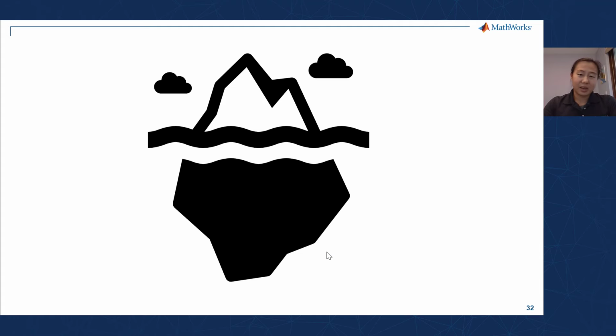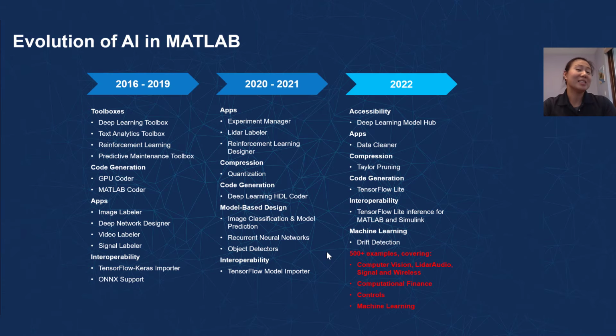All right. Now, I hope by now you might get the inkling that what I've been trying to cover, all the different topics, is very much the tip of the iceberg. There's so much more that you can explore in both just the fields of medical imaging and image analysis and in AI, and the two combined. So I really hope that this session gave you some impetus to go check it out for yourself, to go try something new, and take a look at some of the new recent additions that we have within our toolboxes. Strongly recommend, or ask actually, that you take a look at our medical imaging toolbox. Provide us your feedback. We're very excited to hear from you about that.